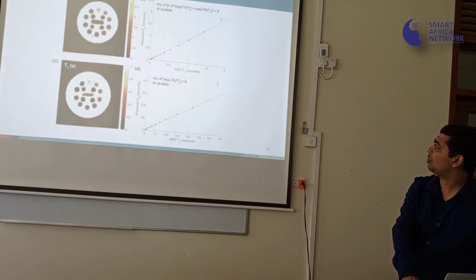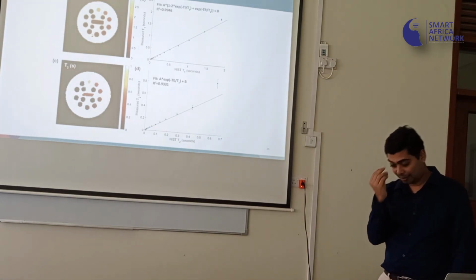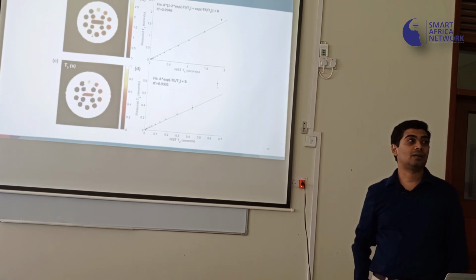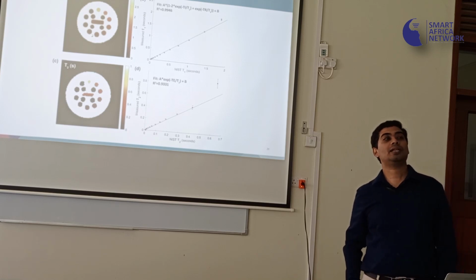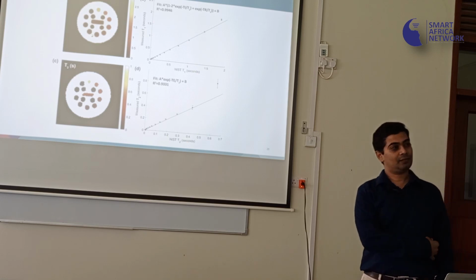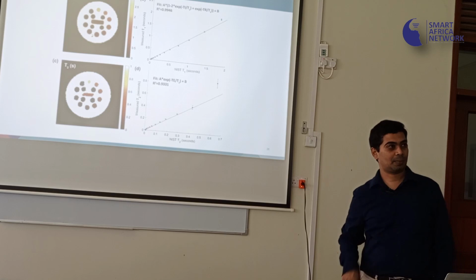An exciting thing that's happening in magnetic resonance over the past decade and a half now is quantitative imaging. If you see a car going on a highway, you'll say it's going fast. That's one way of looking at things. The other way of looking at the same thing is to say it's going at 85 kilometers per hour.